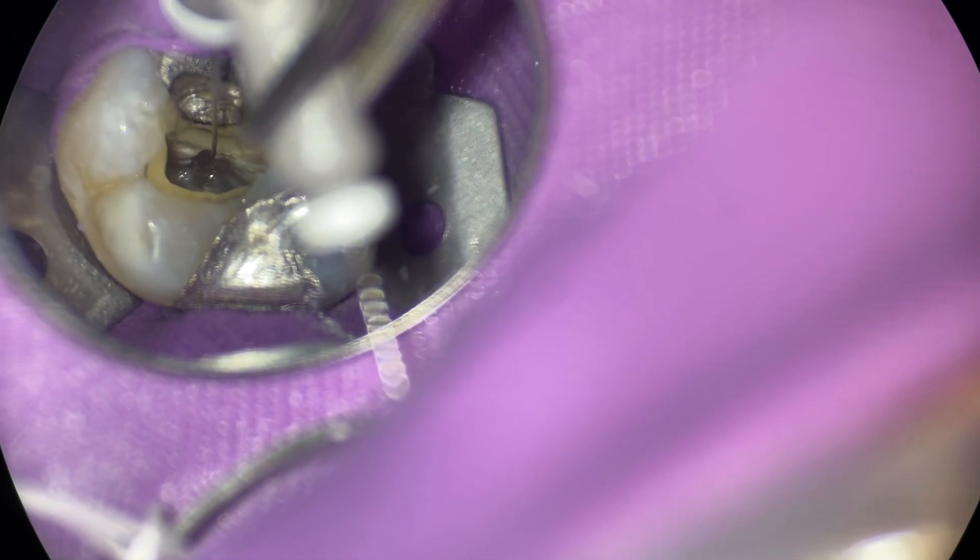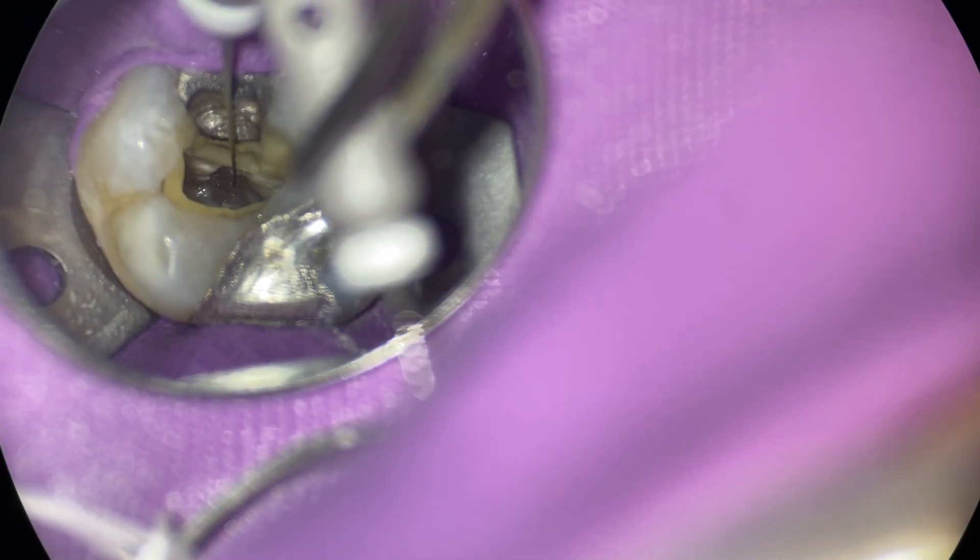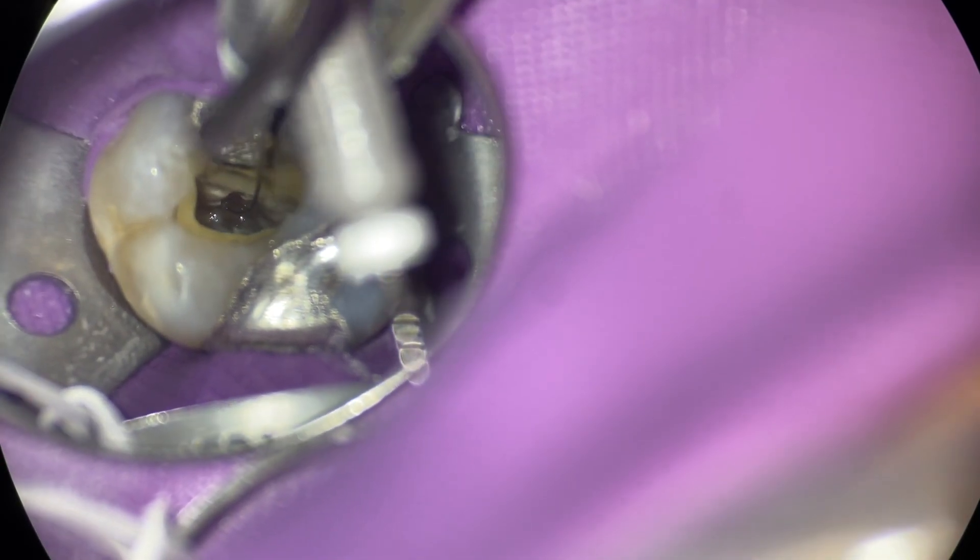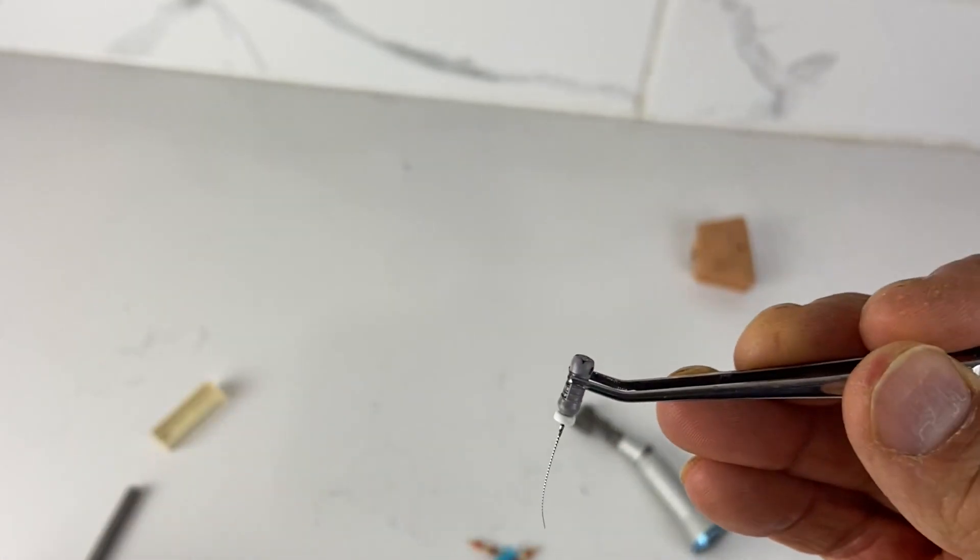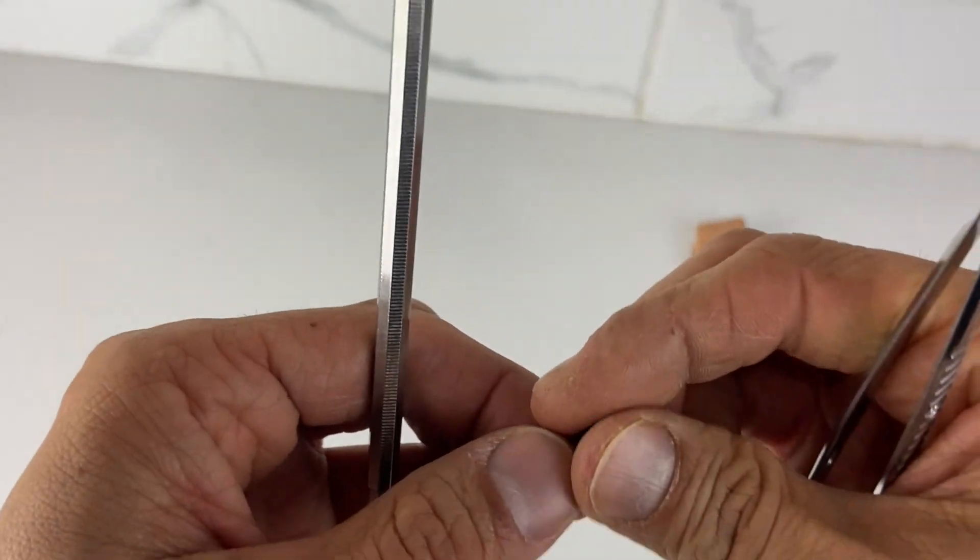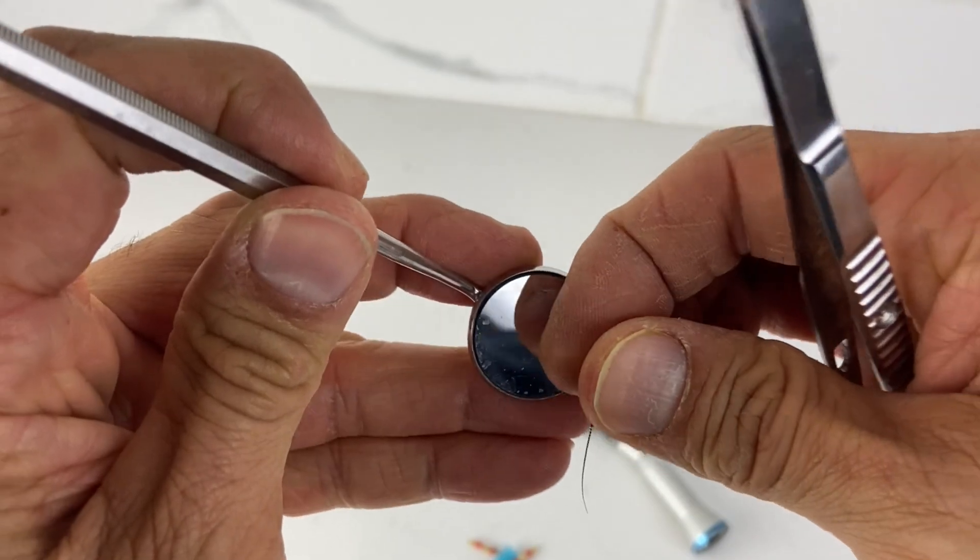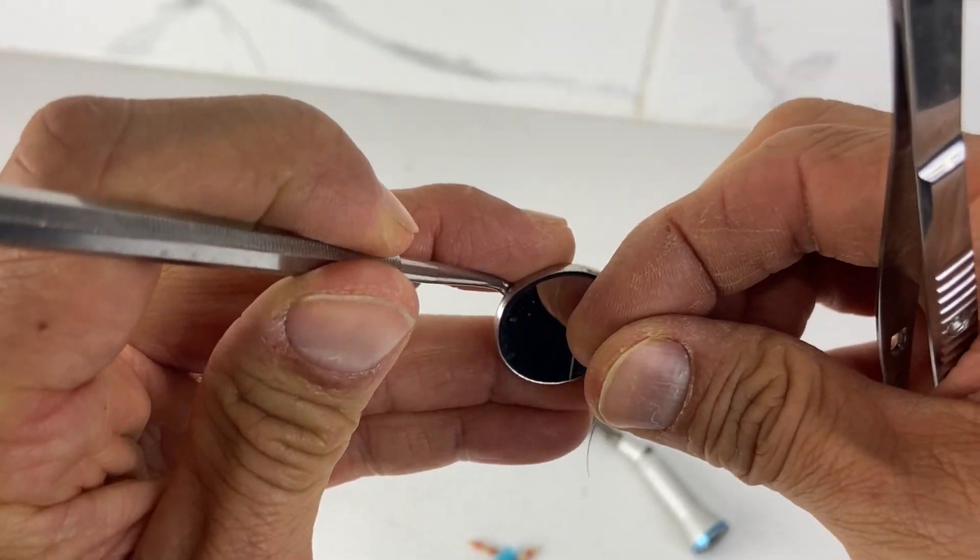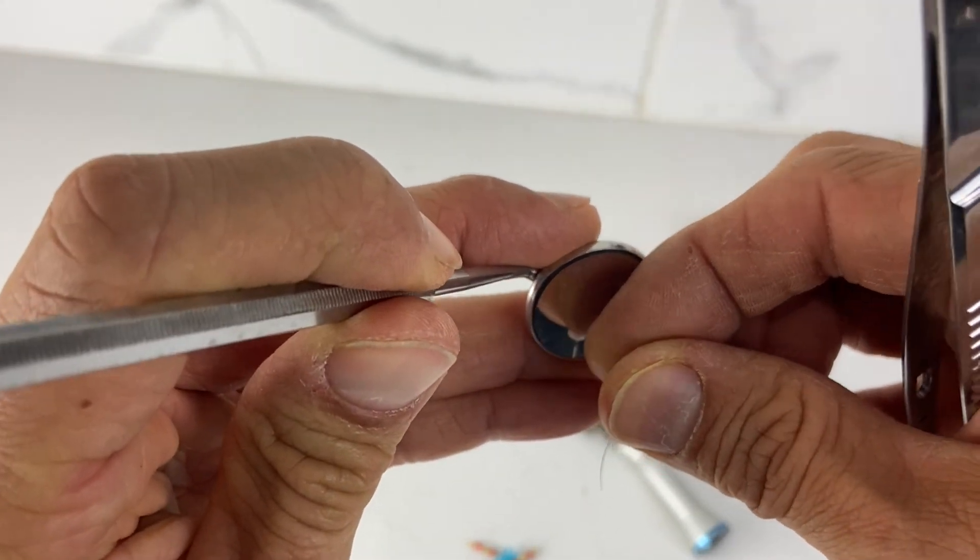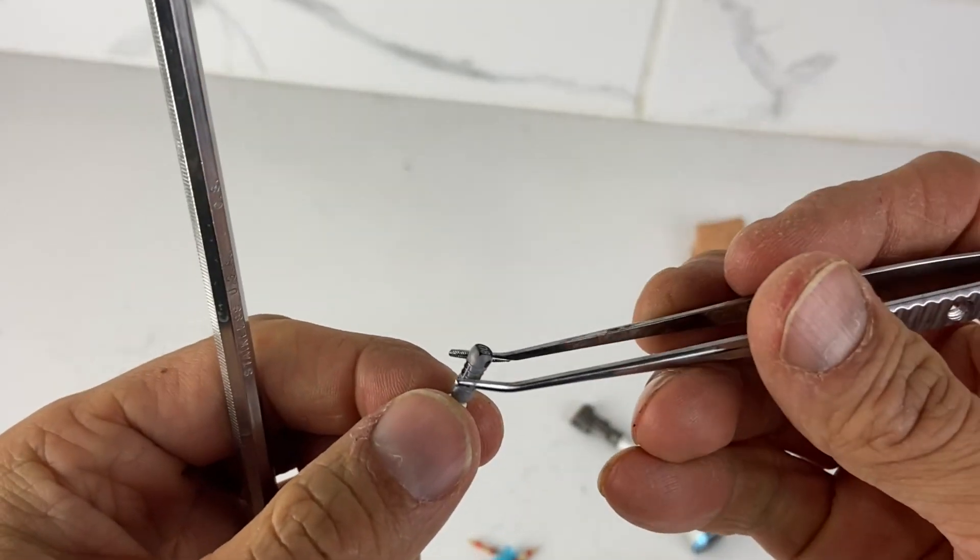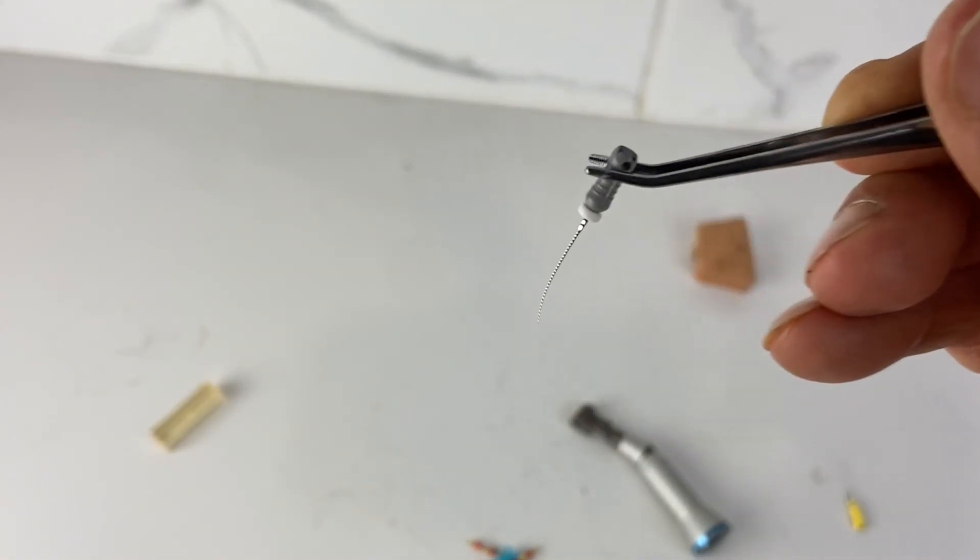So what I'll do is I'll use cotton forceps to place my files, especially on sevens. It's really hard to see what you're doing. So for example, I've got my mirror and you're trying to see what's going on and it's really hard with your mirror. There's not a lot of room. So what I'll do is I'll use cotton forceps and that'll be placement.